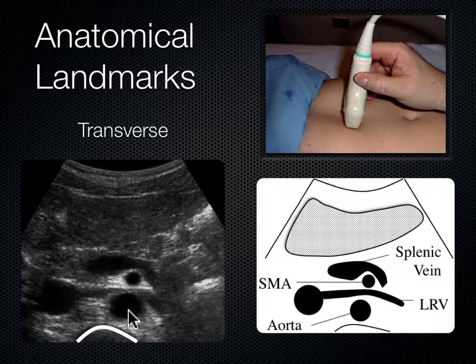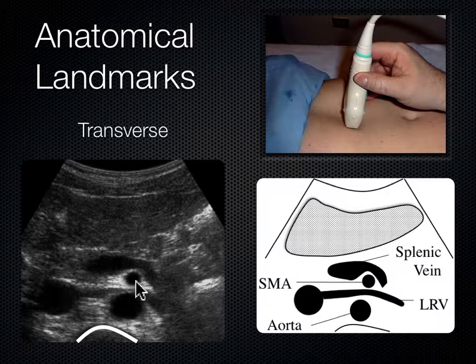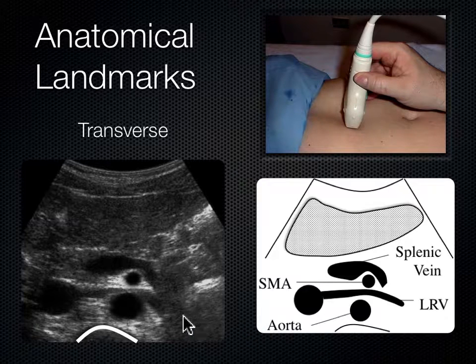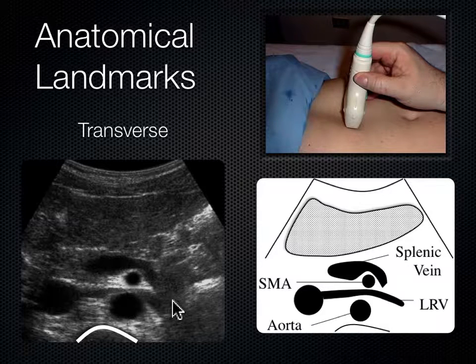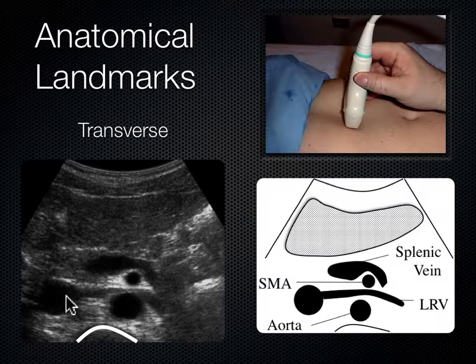If we look between the aorta and the SMA, there's a blood vessel that gets nutcracked between those two vessels and then dumps into the IVC. That's the left renal vein. The left kidney is over on the left side of the body, and its blood has to get over to the right side to drain into the IVC. The left renal vein does that by getting nutcracked between the aorta and SMA to reach the IVC.